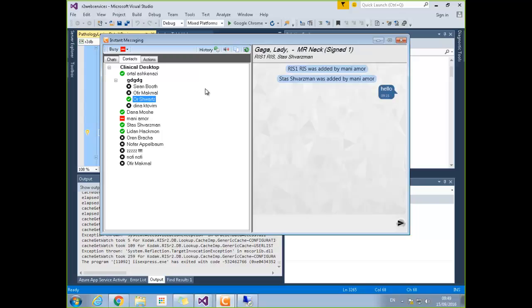Or less. I just want the database to be working well. But I agree, we need to find a balance between auditability and business information, especially if you're checking a study and taking critical decisions. To create such a tool only for chatting, you wouldn't do it. You have WhatsApp, you have Skype, whatever you have. The benefit here is the context.